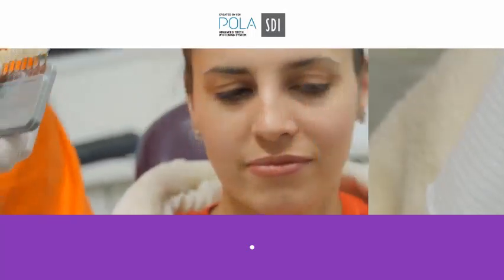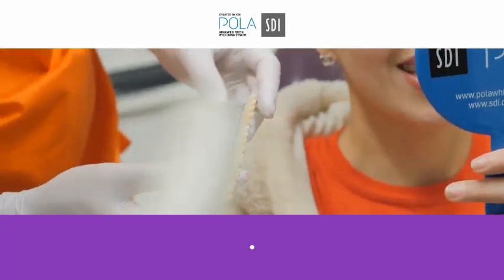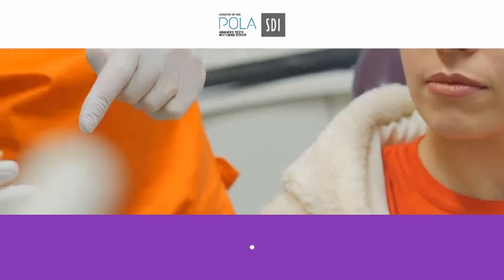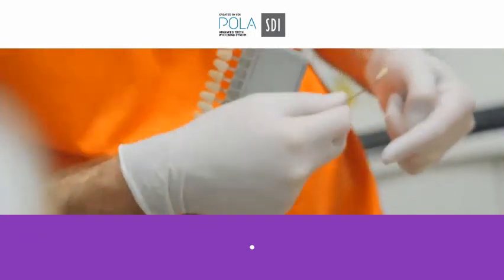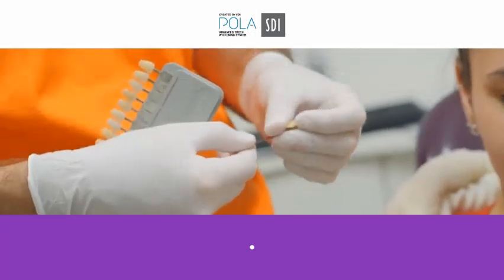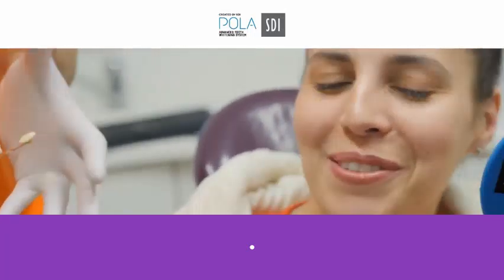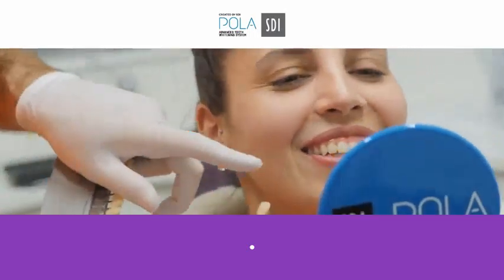So if you bring your mirror up for me, we'll have a look at the bottom teeth. Now we'll have a look at the canine. And we're not that dark, but compared to your peers in the pageant world, your teeth will feel dark. Yes. So as a normal St Helens girl, your teeth aren't dark, but compare yourself to the bleached world. Yeah, you're very polite there. Right, put that back for me if you would.